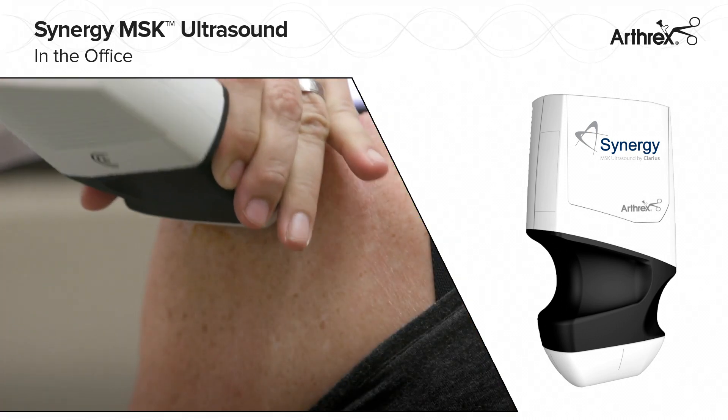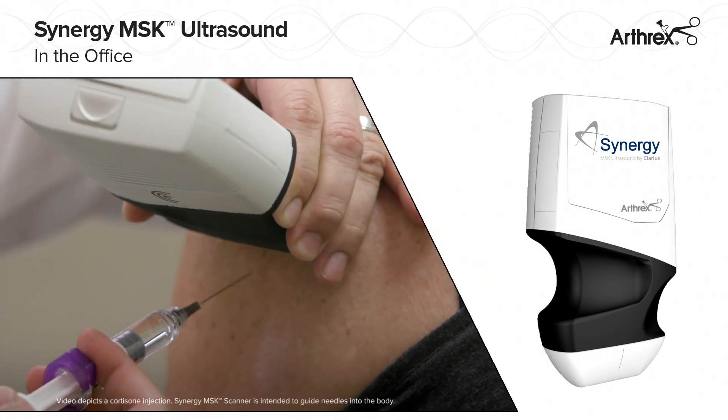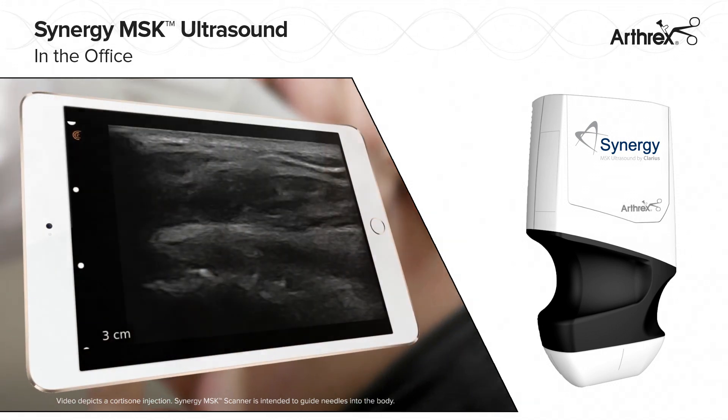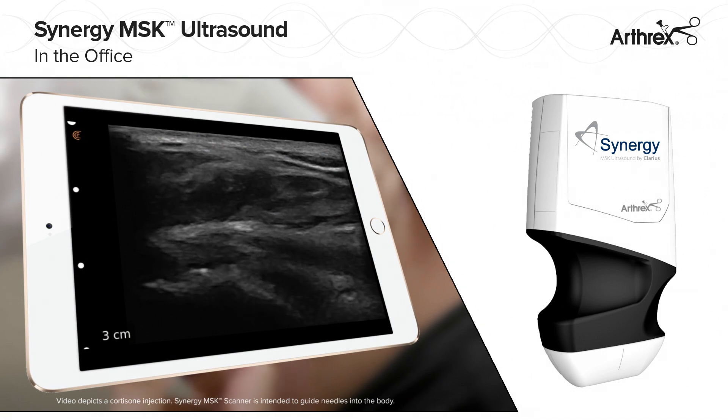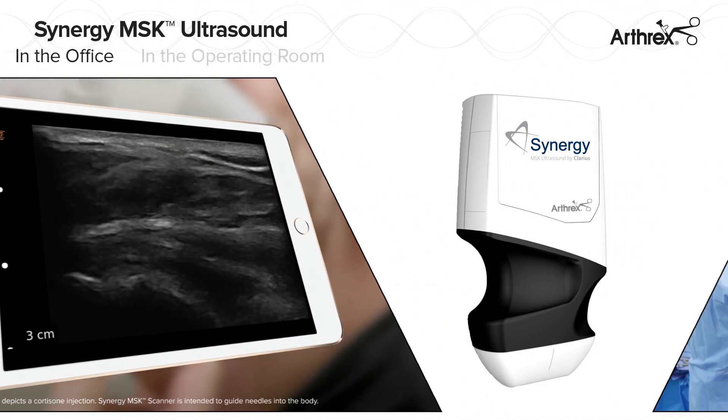Synergy MSK Ultrasound enables quick examination of patient anatomy and needle guidance under continued visualization. The lightweight metal-encased wireless design provides the freedom of portability from the office to the OR.